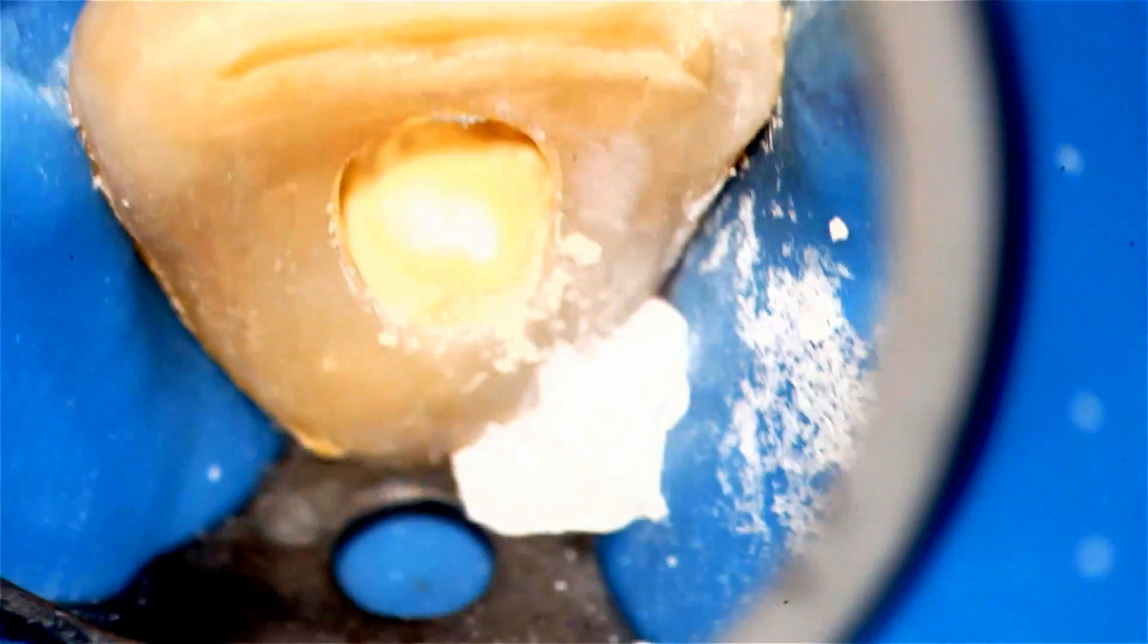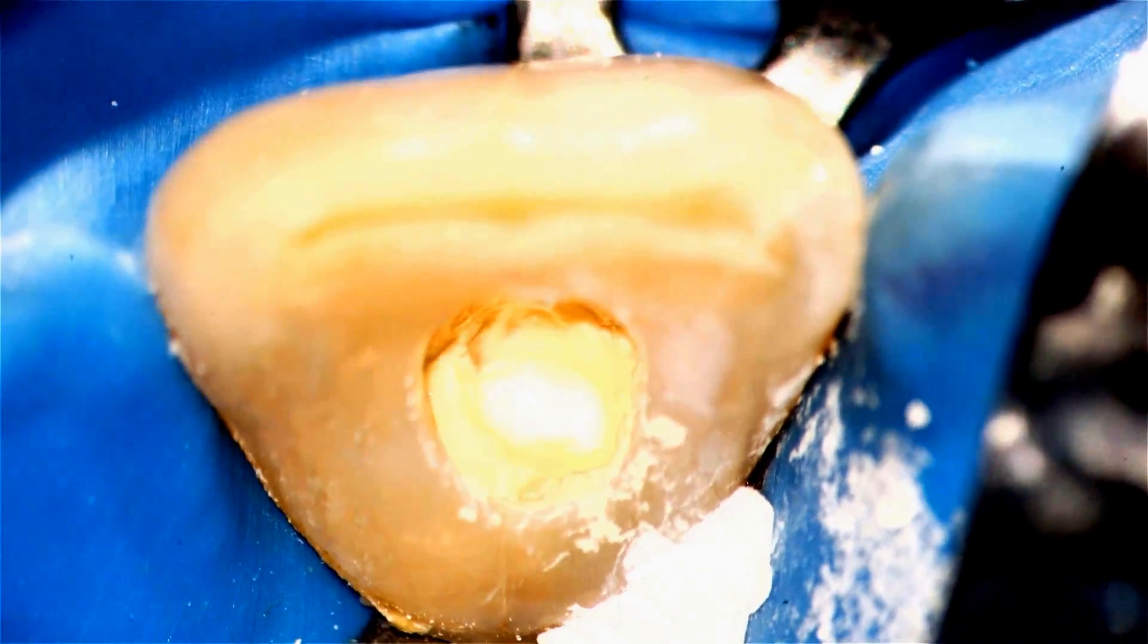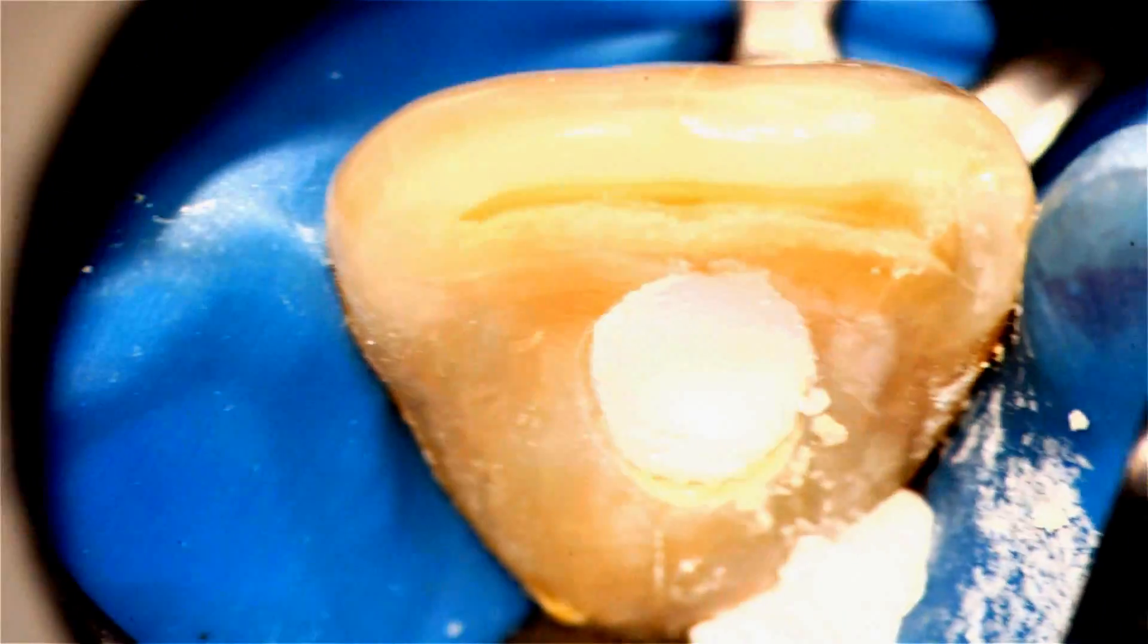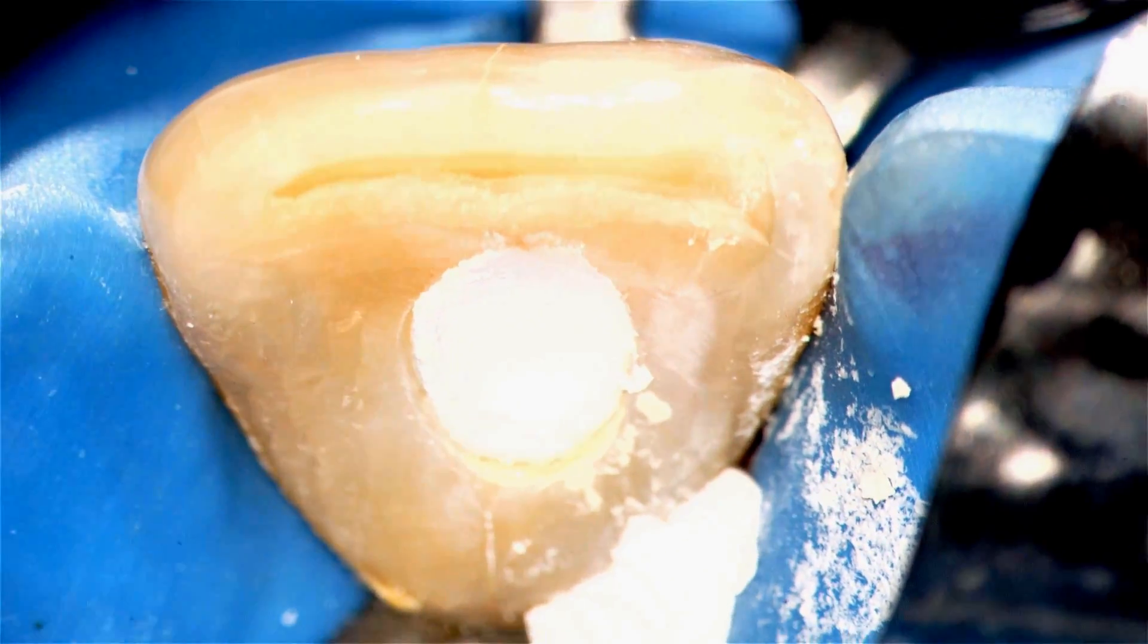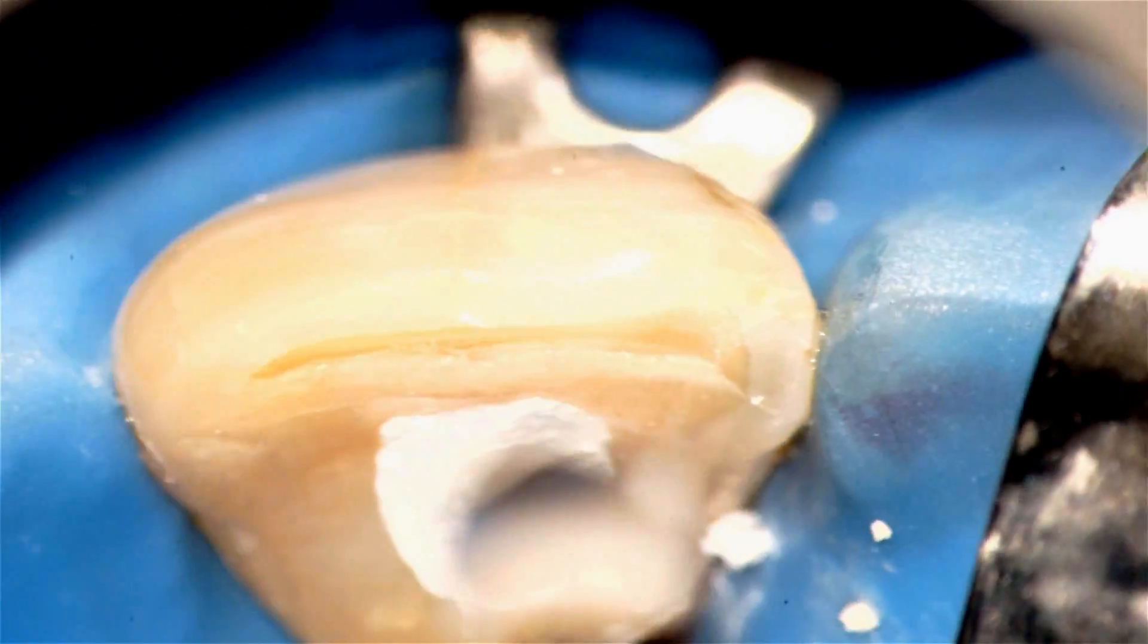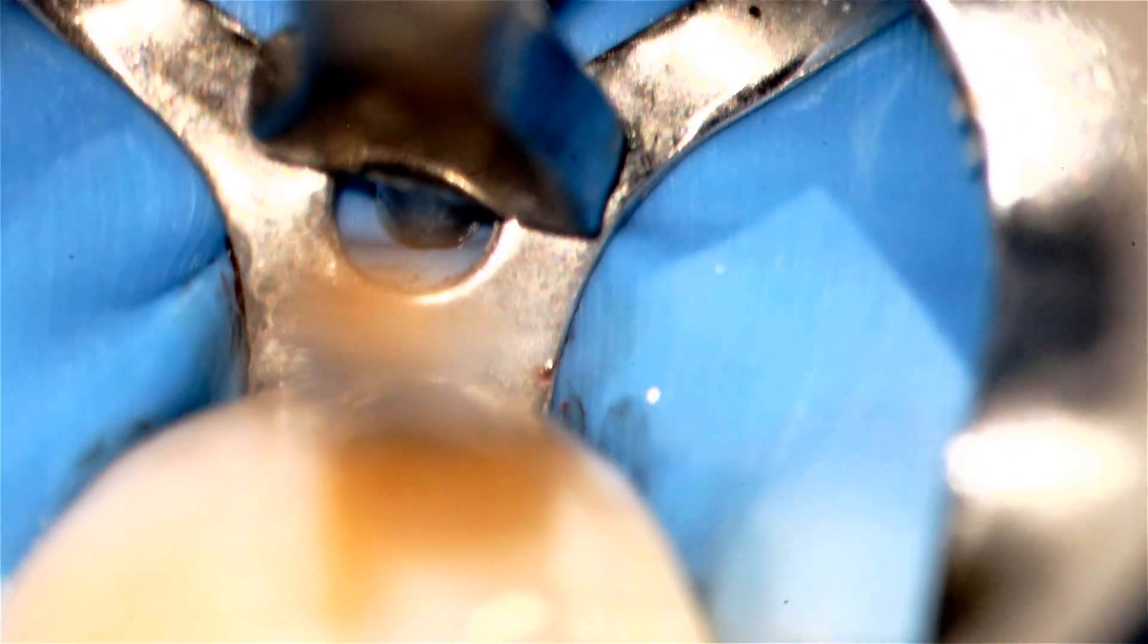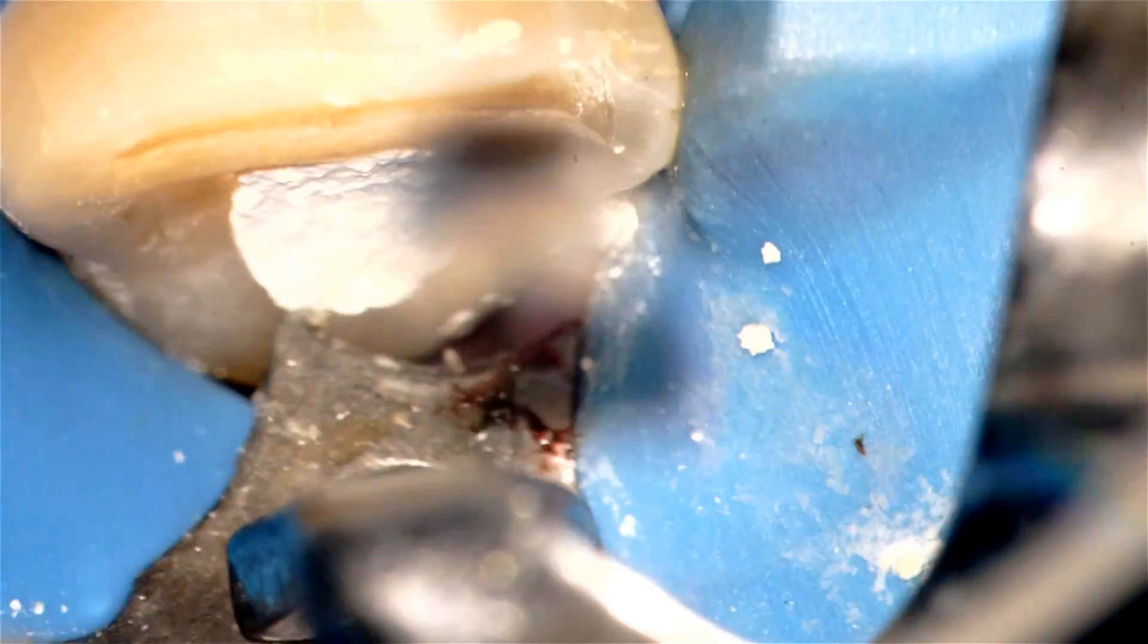I never put cotton spacers in teeth that I perform endodontics on. I like a complete solid fill of temporary, right up against the root filling material. So there it is. That was Cavett that I placed at the distal lingual just to kind of seal it to make sure I didn't express any out. When I press the Biodentine down, taking off the clamp, and the obturation is complete.